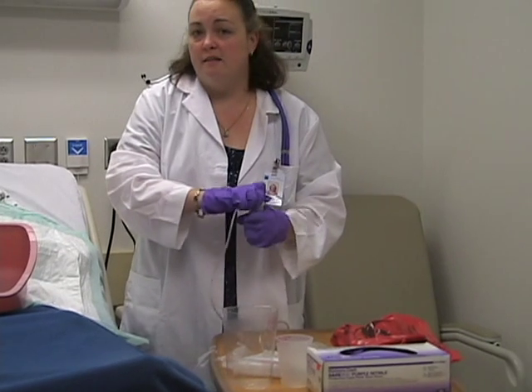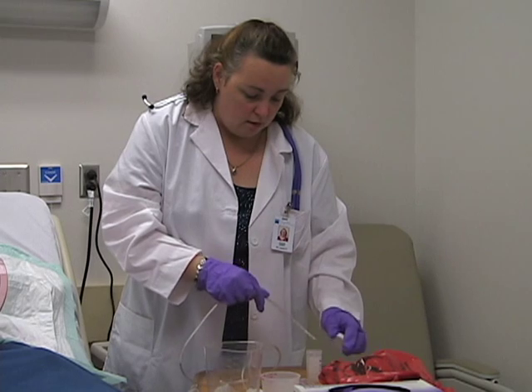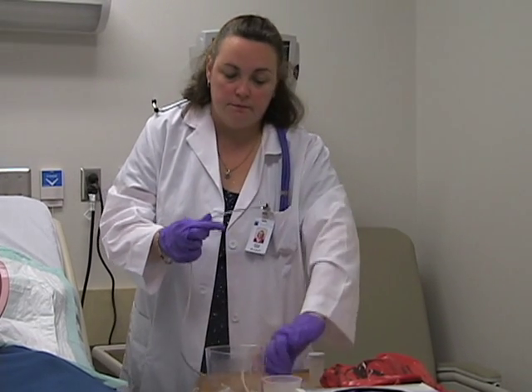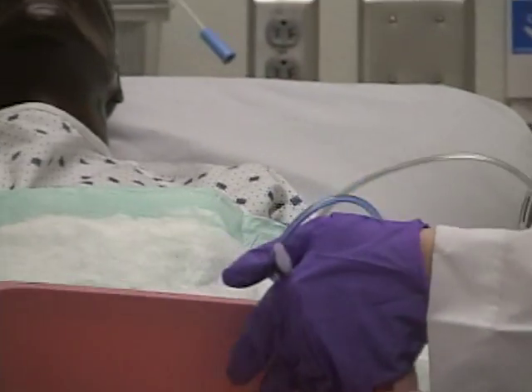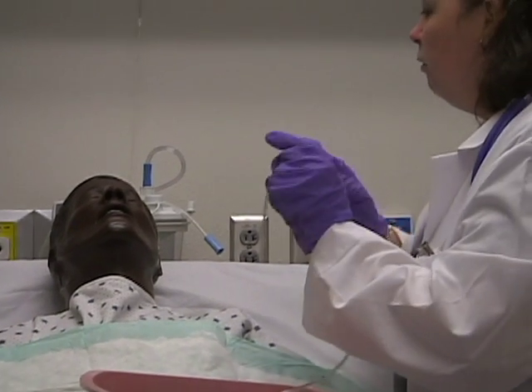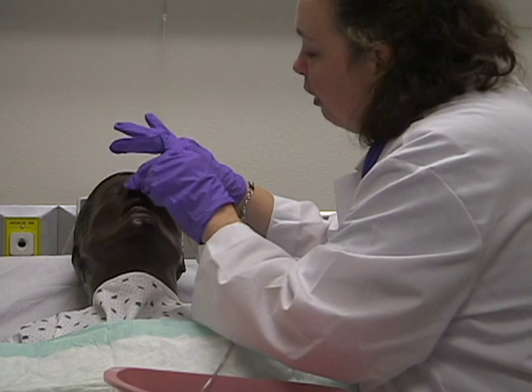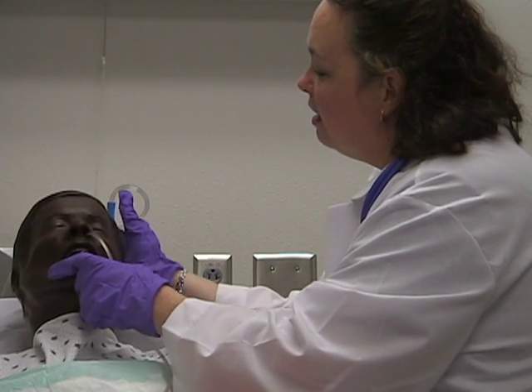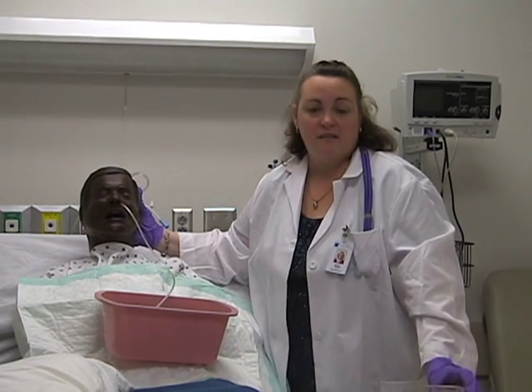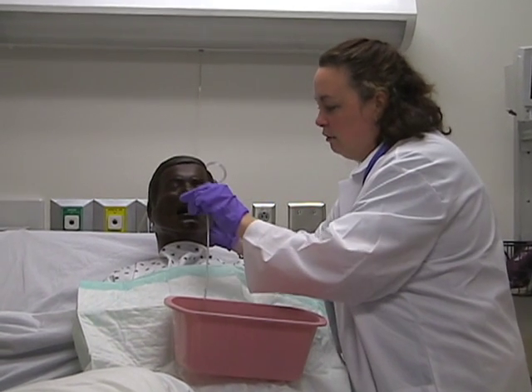It's always important to use a water-based lubricant when inserting any tube or device into the human body — oil-based lubricants are very irritating to mucous membranes. With the landmark tape marking in place so you know how far down to go, begin inserting the NG tube. As it hits the back of the throat, the patient will start coughing. When they do, flex the head forward and tell them to swallow — you may have them sip through a straw. Swallowing increases the peristaltic reflex in the esophagus, and as they swallow you can advance the tube farther down until it enters the stomach.